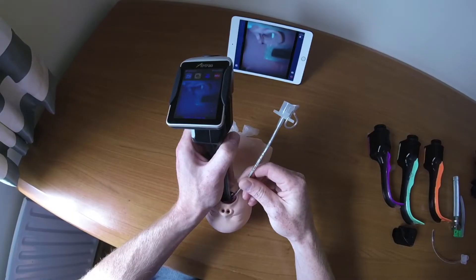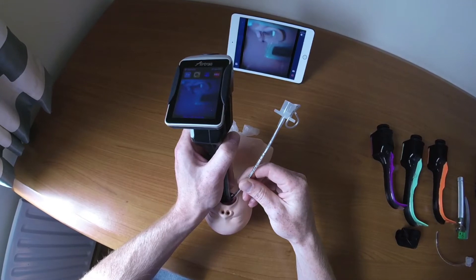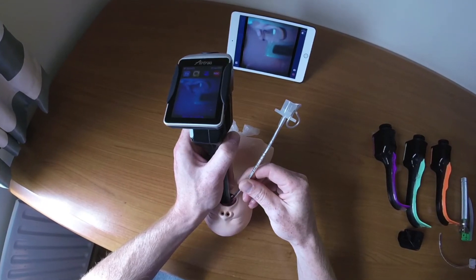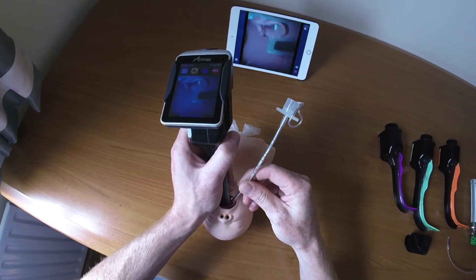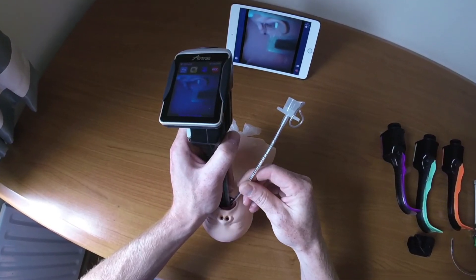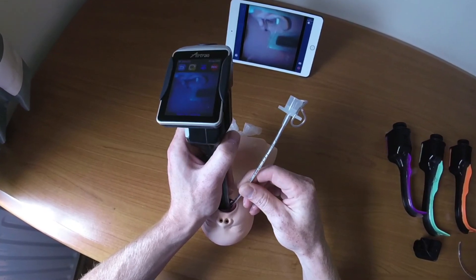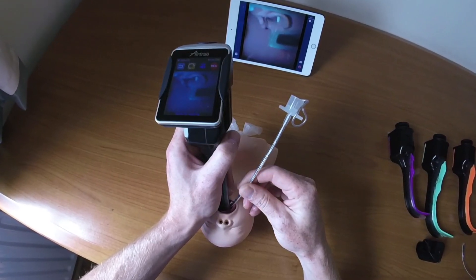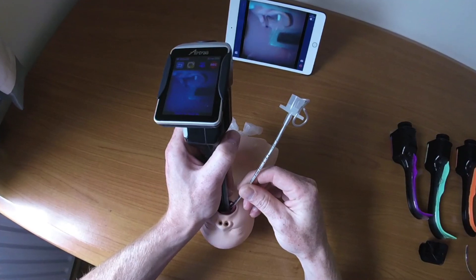This video has demonstrated the standard technique for using the paediatric Airtrack. A novel method using a stylet inserted only into the bottom of the channel has also been developed, which is particularly helpful in smaller patients. A separate video demonstrating this technique is available and worth checking out.